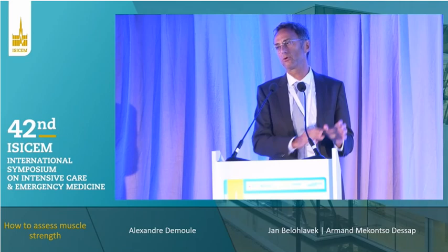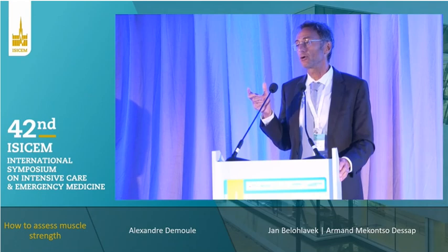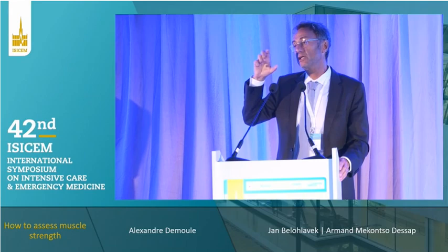Mark from Barcelona. So you use the cutoff value of 30% with a pressure support of 10. With the 0, 0 would be the same kind of value? So it might be a little bit different. It might be a little bit higher, because the lower the pressure support level, the higher the thickening fraction of the diaphragm.